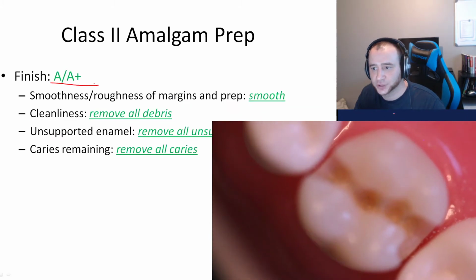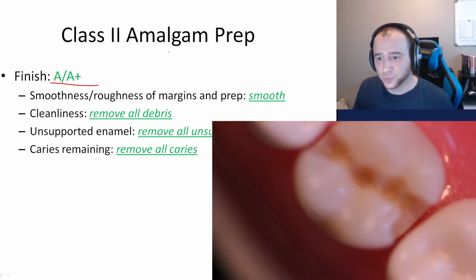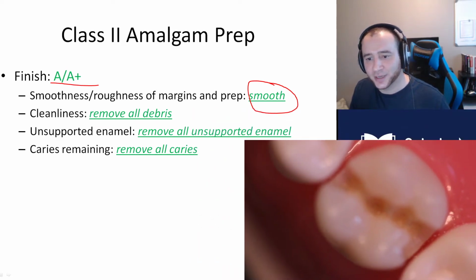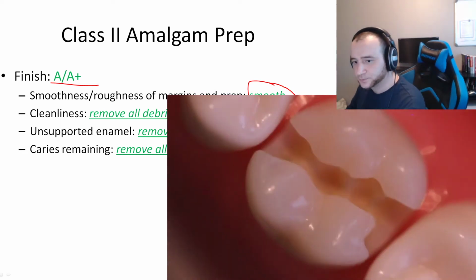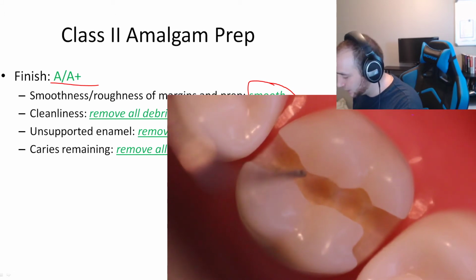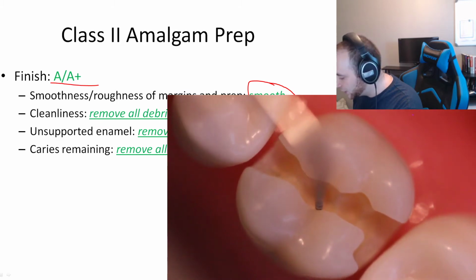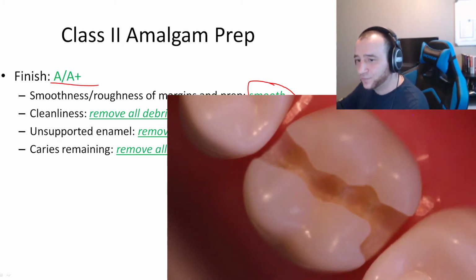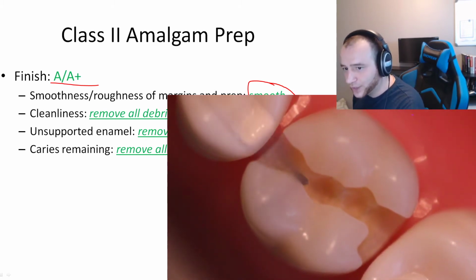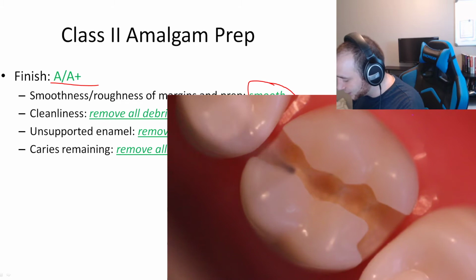So how do we pass the finish? There's not much to say except to practice making your prep smooth. I'll tell you a technique to help you make it smooth. If I take the handpiece and the bur and I move along the walls of the prep slowly, and I push down on the pedal halfway, not all the way, not with full speed, then slowly it'll give me a smooth wall. That's one technique, and I like to use that one.